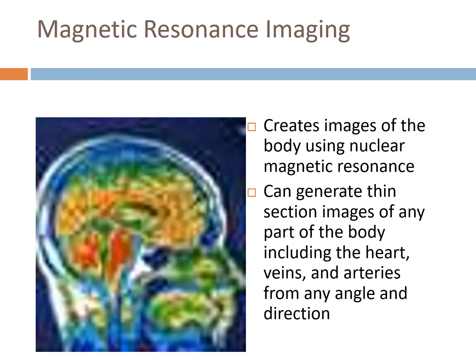All right, MRIs. MRI uses nuclear magnetic resonance. One thing about the MRI, you have to be very careful when you go in there because it is basically a large magnet. So there is protocol to be followed. In the CT scan, it's a little bit easier to go in and get your patient set up, and you just need to leave the room or put lead on when they actually turn the scanner on. In the MRI room, you are not going to be in there unless there's something funky going on.